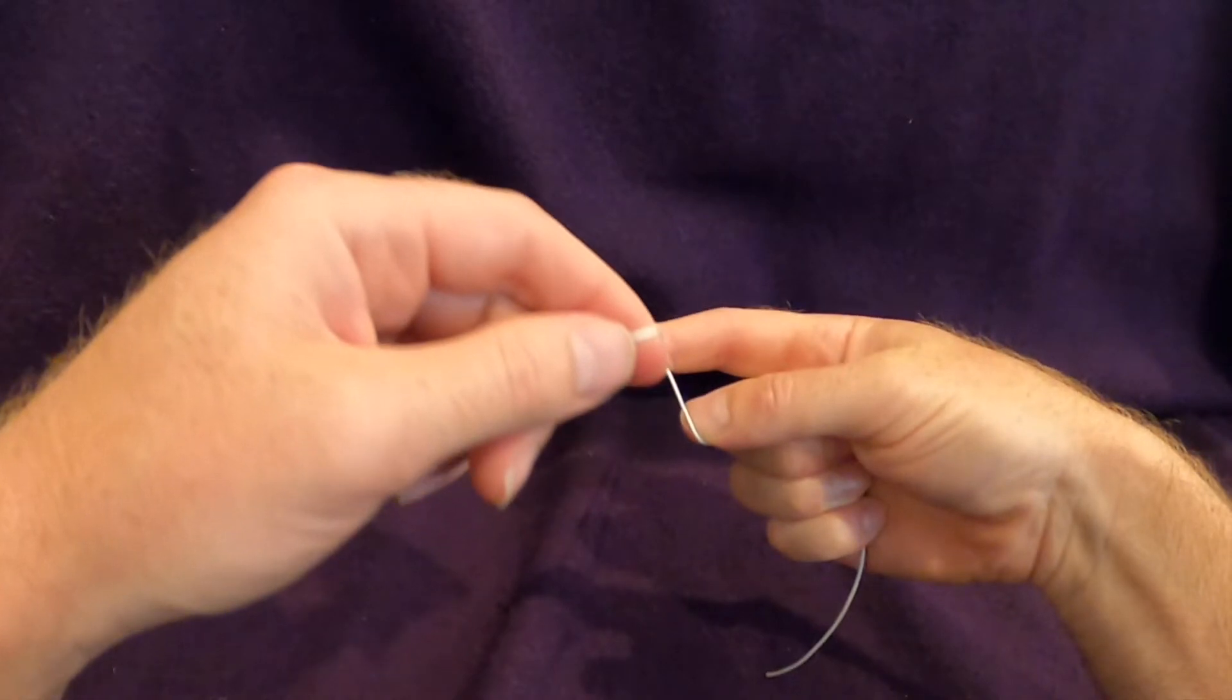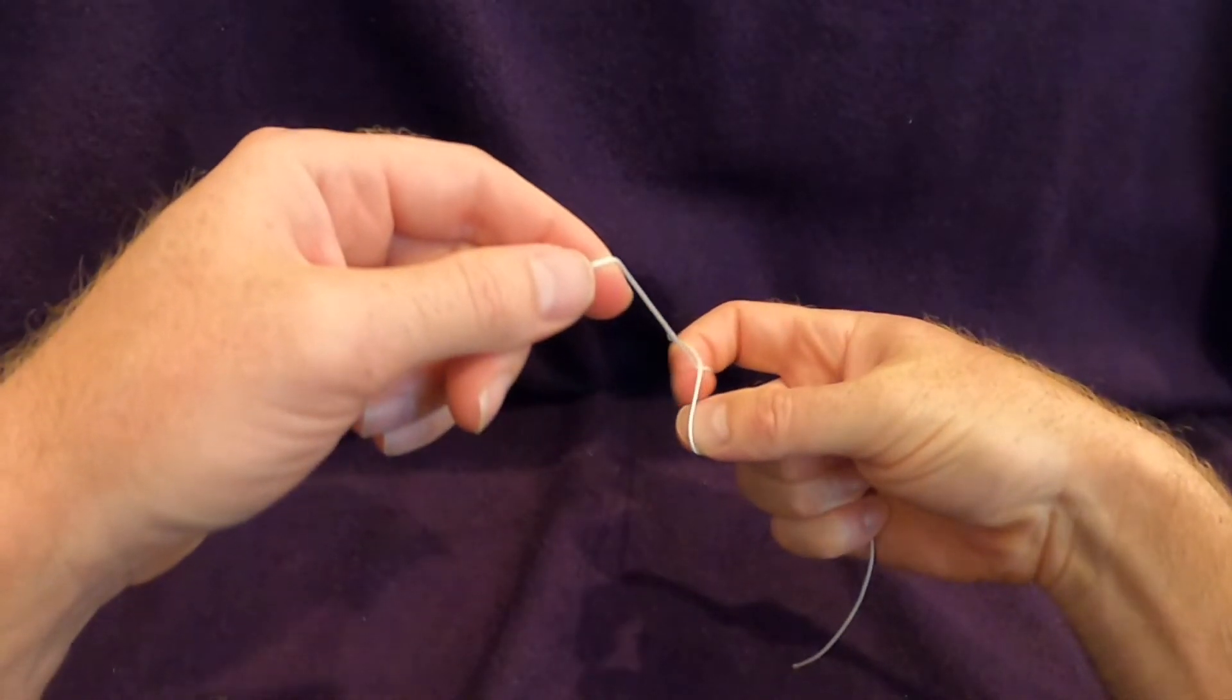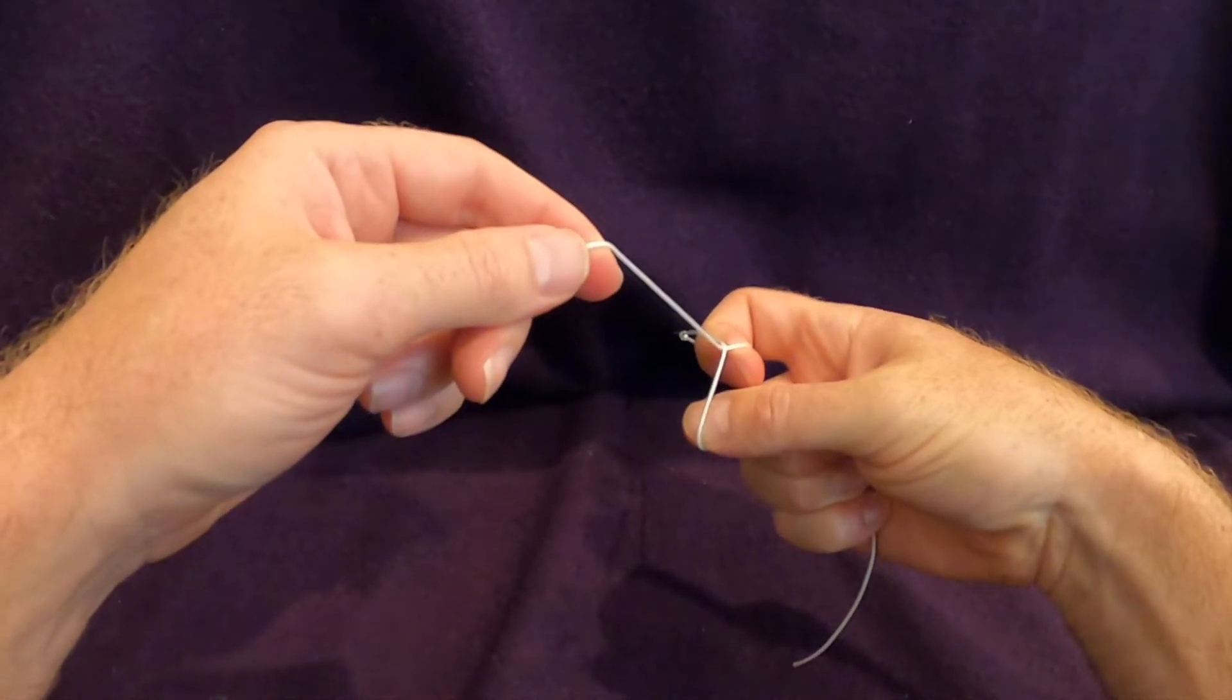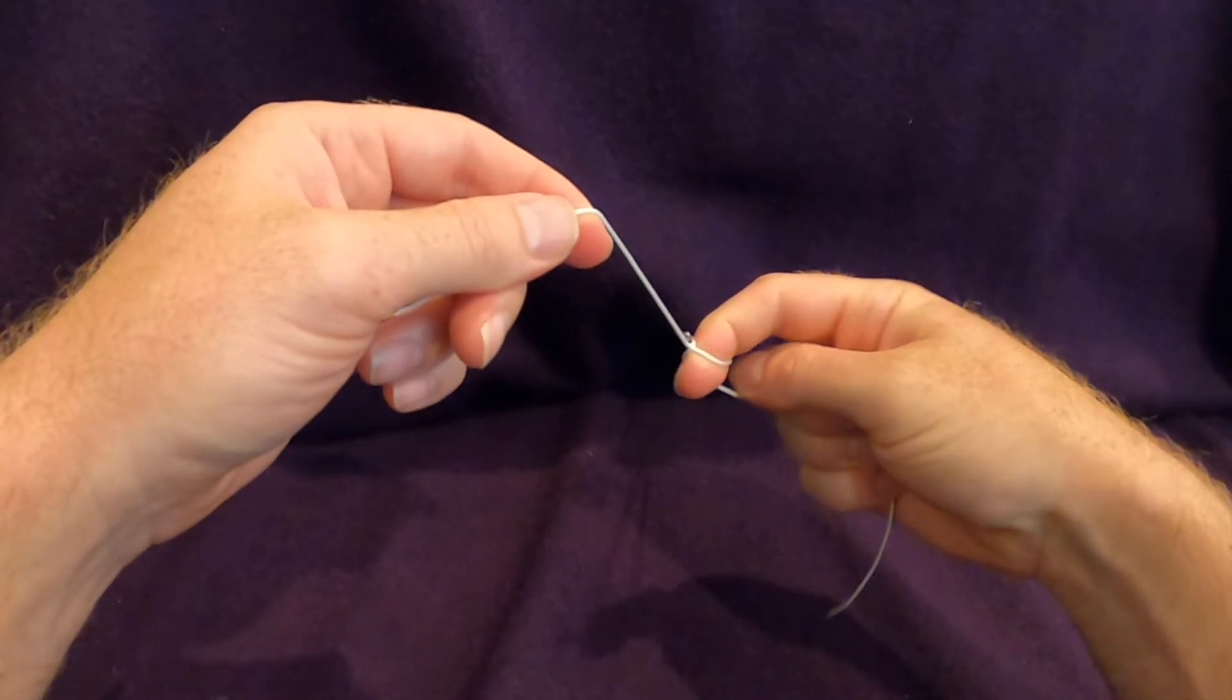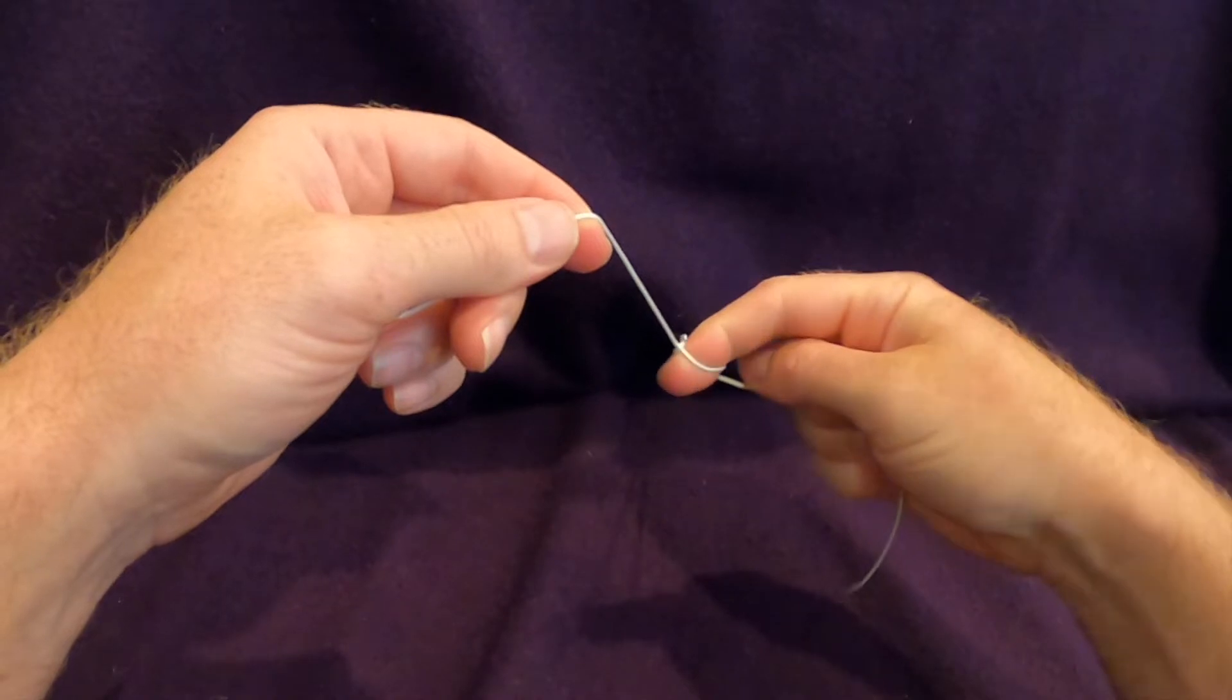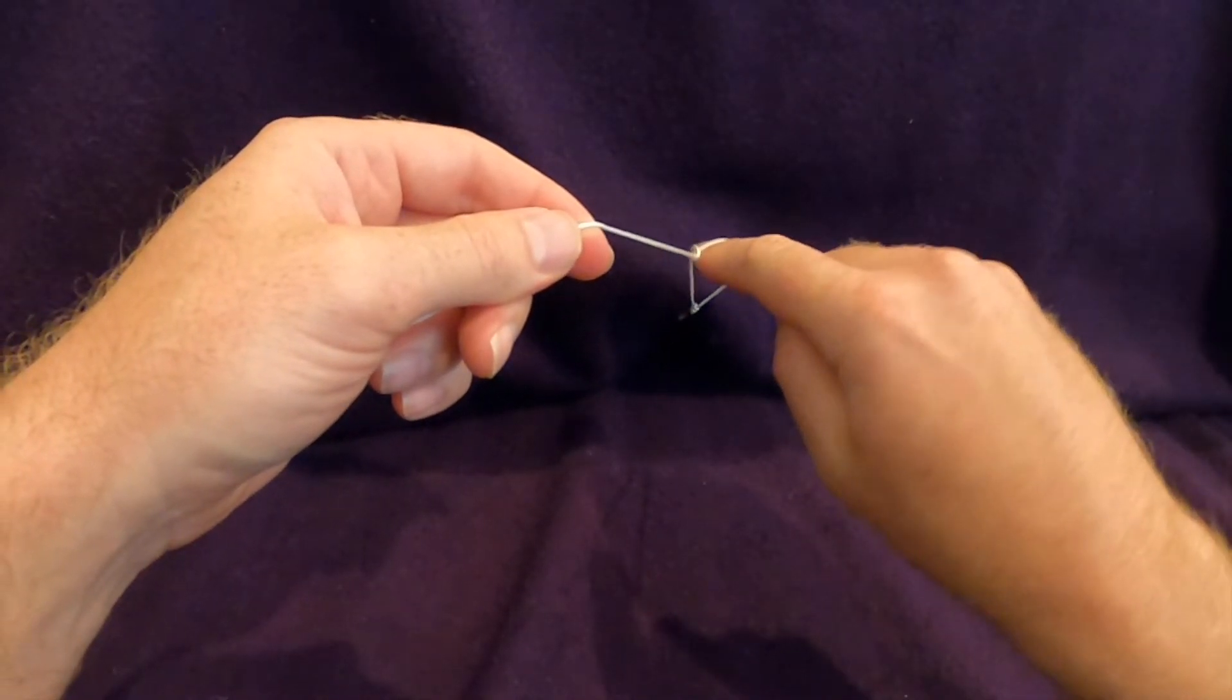The left hand suture is brought across the fingertip which then hooks the suture and rotates it through the loop that's created by the right hand suture. The right hand suture is now on the fingernail side and as the hand rotates it pulls this through the loop.